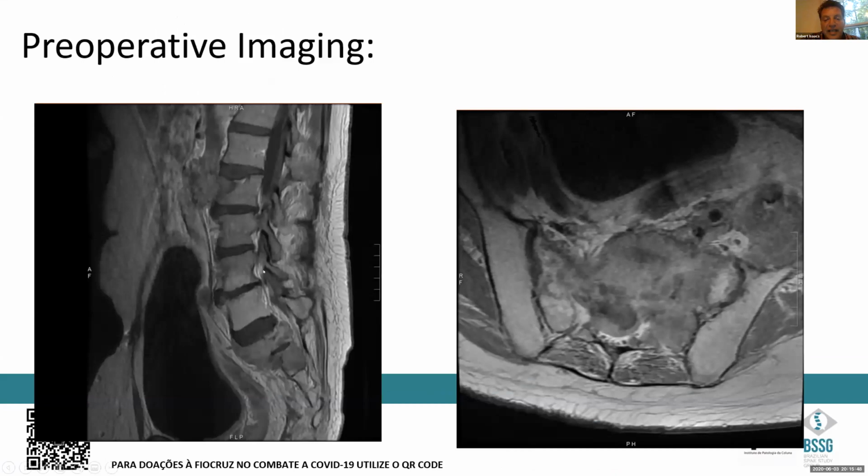Or if you look at a case like this, where a person is unfortunately riddled with some fairly significant metastatic disease, and his entire sacrum is eaten out and he has tremendous back pain. And really, there's not a lot of good anatomy to typically place instrumentation.